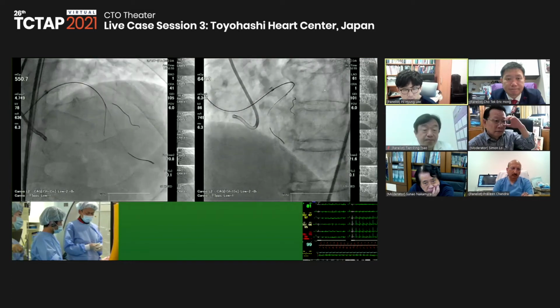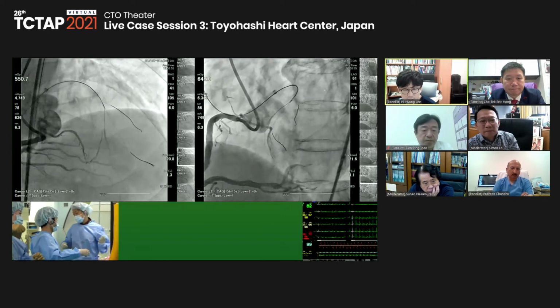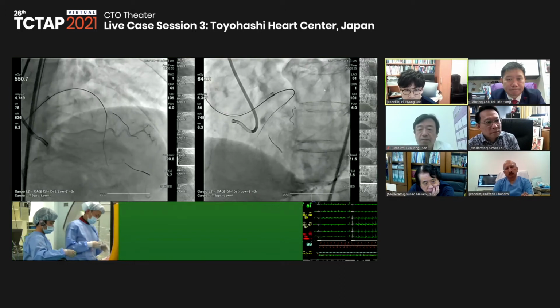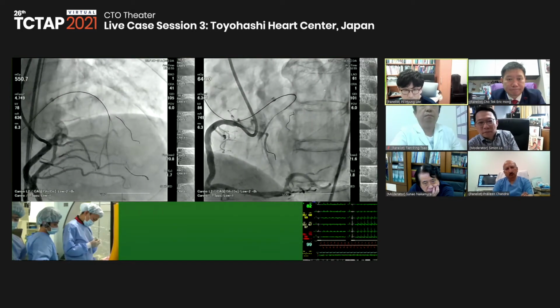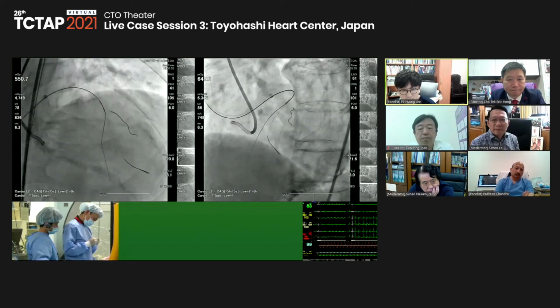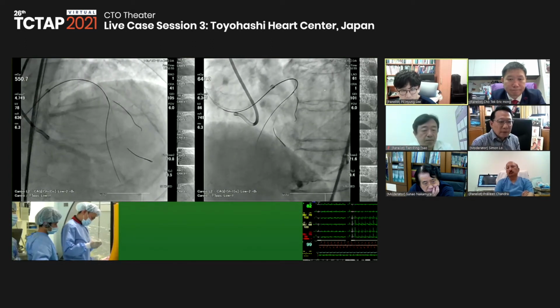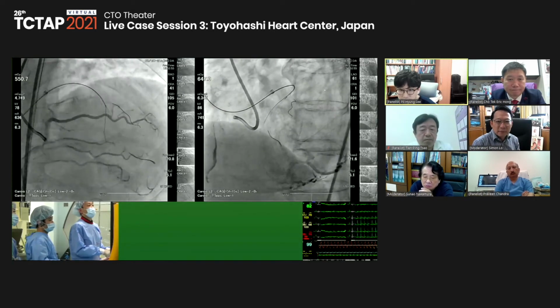I would just do the crossover stent first and then look at the diagonal. I think the diagonal will not be jailed after the crossover stenting, because I see that the morphology is quite good for a single stenting.